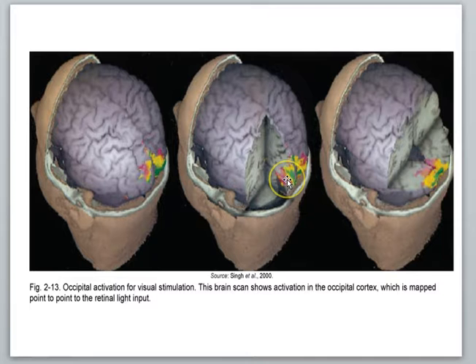So red might be assigned, these areas in red show high activity relative to other areas of the brain for the particular task that the person was doing. Yellow might be a little less activity, green even a little less. Because the activity is shown here in the back of the brain, we know this is visual cortex. This person is likely doing a visual task. So the fMRI technique is showing not only a structural view of the brain, but also a functional view of the brain.